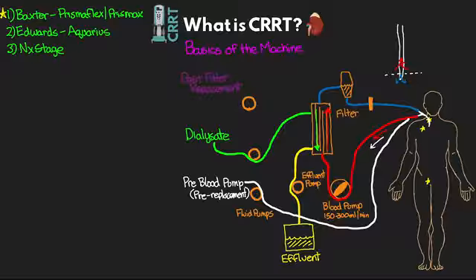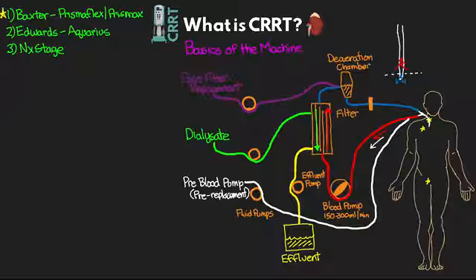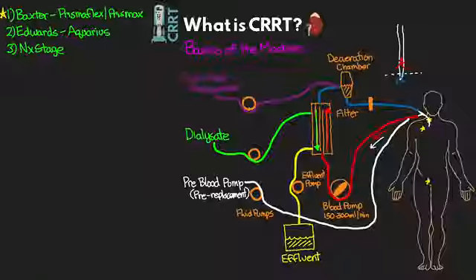And then finally, we have our post-filter replacement. And so again, we're going to have the pump that's going to move this fluid along, and it's going to meet up, in the case here, right at the point at which the blood is going into the deaeration chamber. And so this means that this fluid is being mixed with the blood after the filter and just prior to going to the patient.